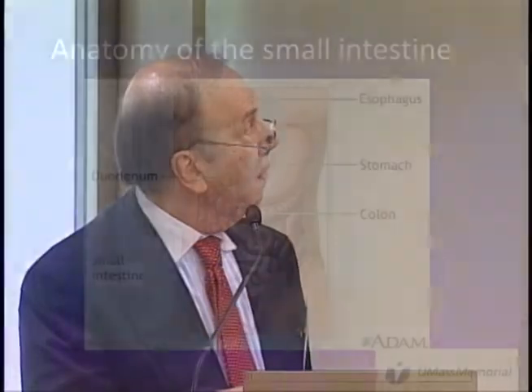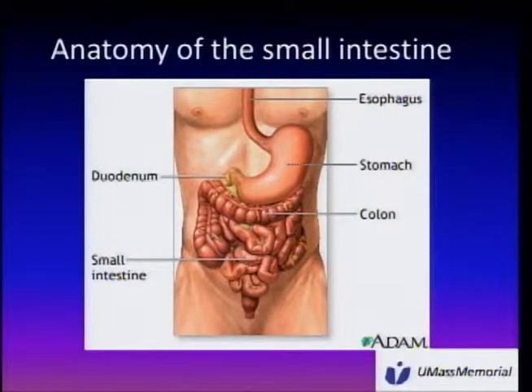And again, what I would like to do is to try to reference the bony parts: this is the rib margin here and here, and the pelvic bones are down here and down here, with some sort of reference of where we are within this knot of the small bowel, which is a three-dimensional issue because it's stacked up on top of itself.